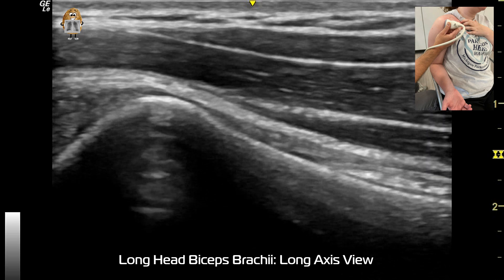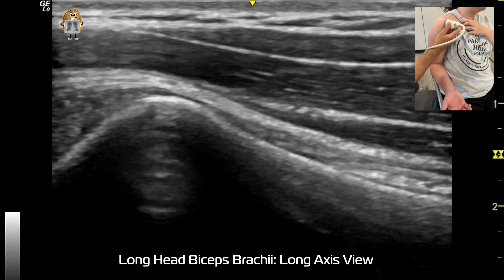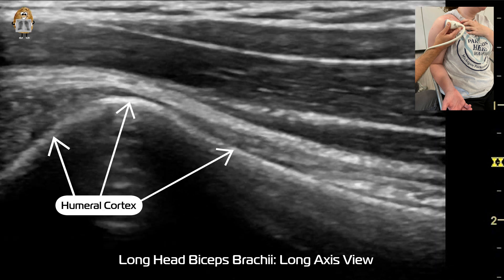Now let's take a look at a long axis view of the biceps brachii tendon. So again, a still shot — let's identify the cortex first. You can see the orientation of the transducer has changed now for this long axis view.